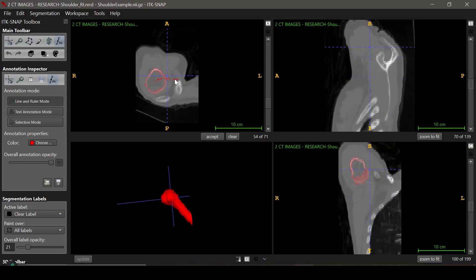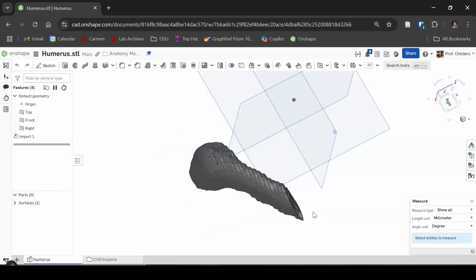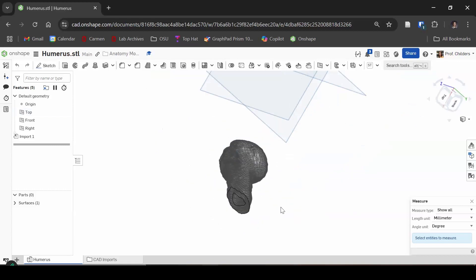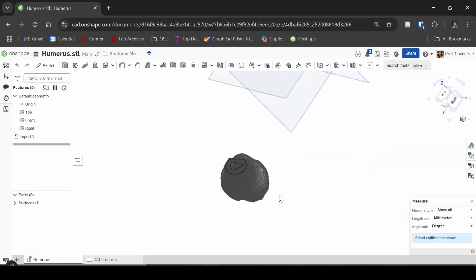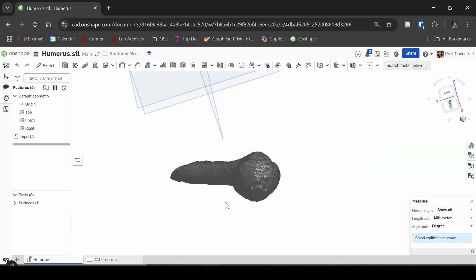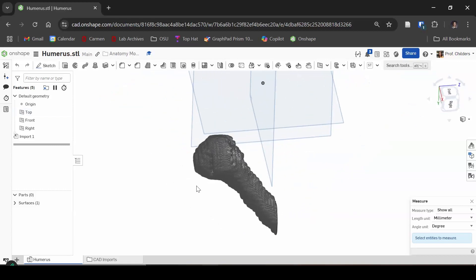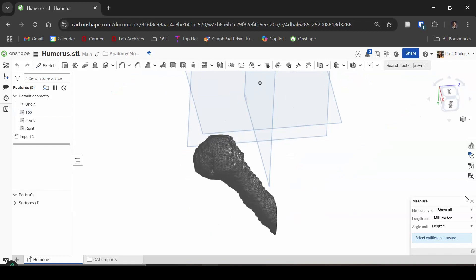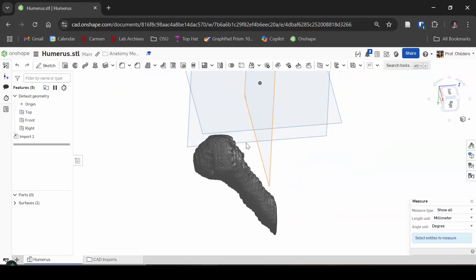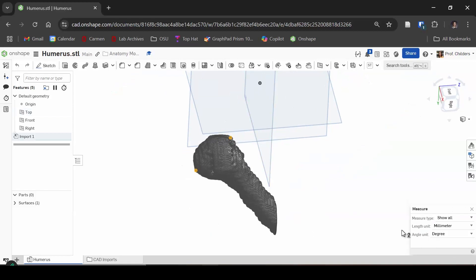With a 3D model and 3D software, you can measure the features that are out of the plane.